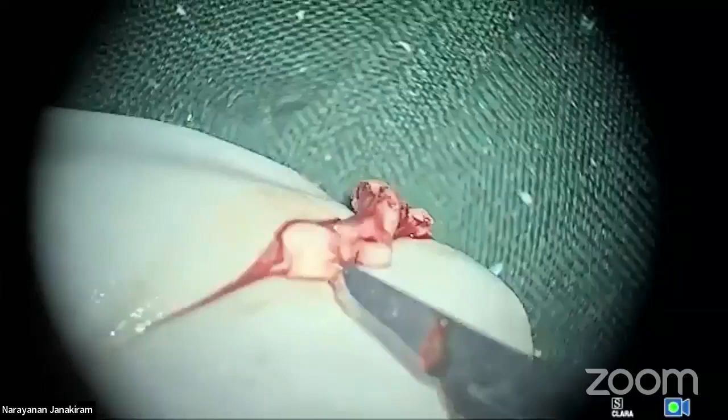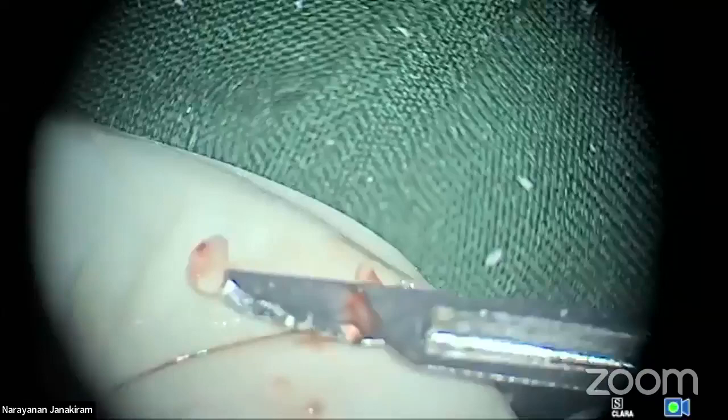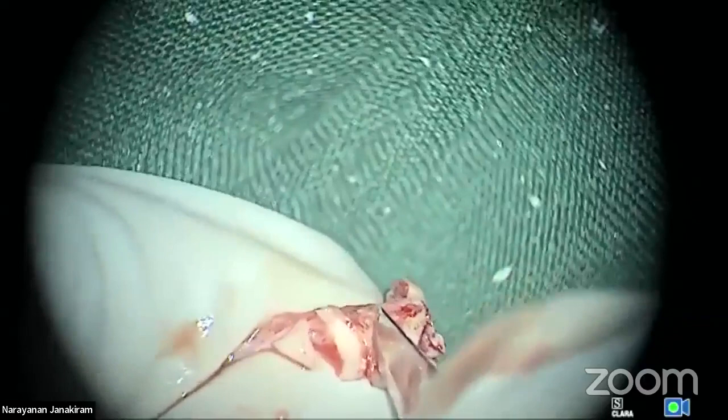Give me a knife. Quick. Now, this will be the stapes cartilage. This will be for the hypotympanum. See here. This is for the hypotympanum. So, have a curvilinear cartilage for the hypotympanum. This hypotympanic cartilage is kept to augment the height of the middle ear space. Let's go. Wait. Okay. Now, the next step is to get something like a columella. And you have to stabilize it.